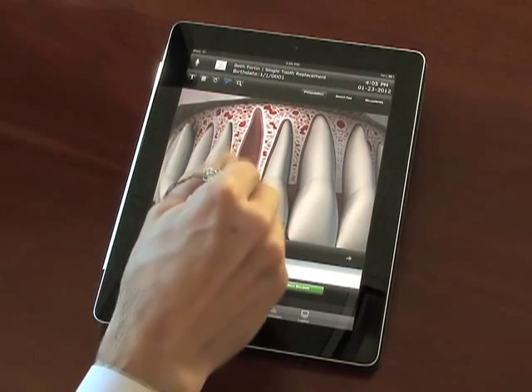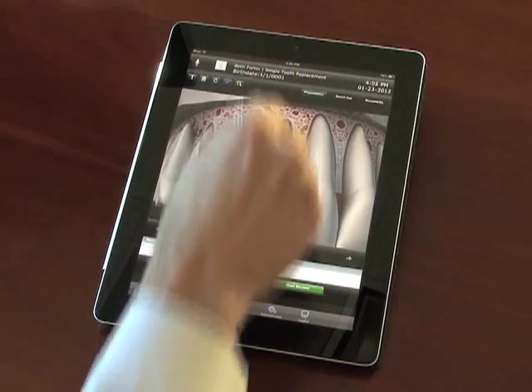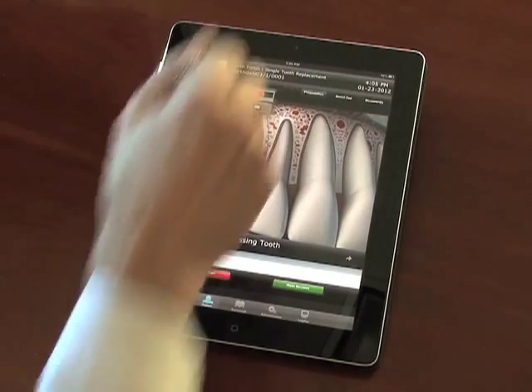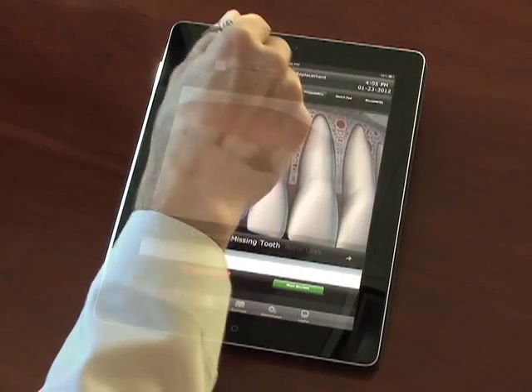You can use the built-in drawing tools to mark up CG models and other images.